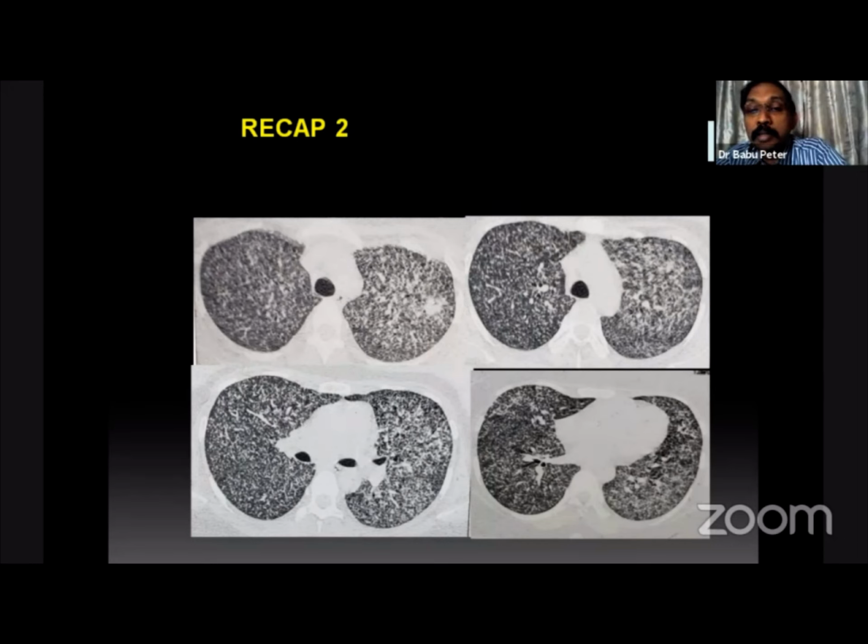The patient was also subjected to HRCT, in which we recognized these abnormalities. These are tiny uniform-sized nodules, which are bilateral and symmetric. This pattern is classical of a miliary tubercular pattern. Whenever you see this pattern, you can always consider miliary tuberculosis.